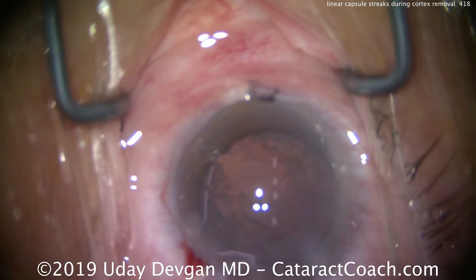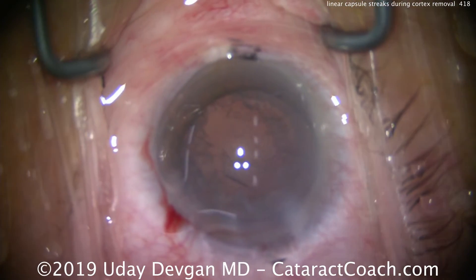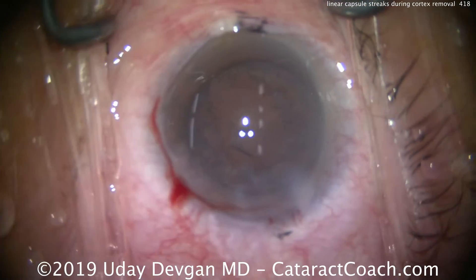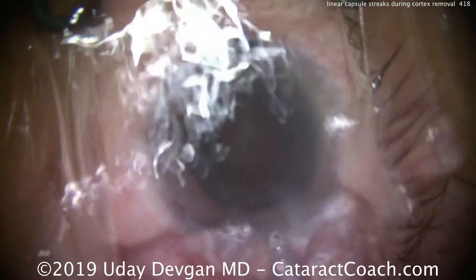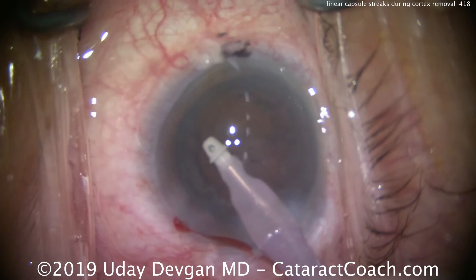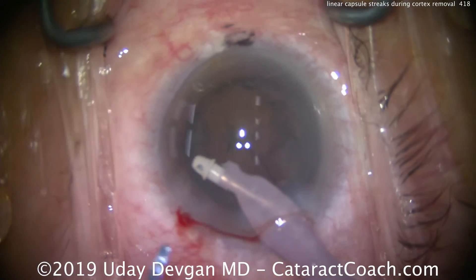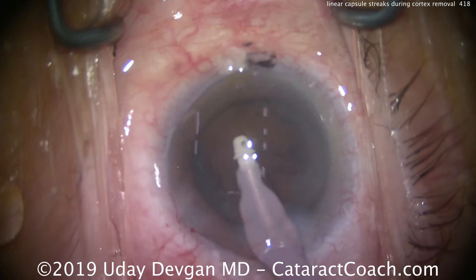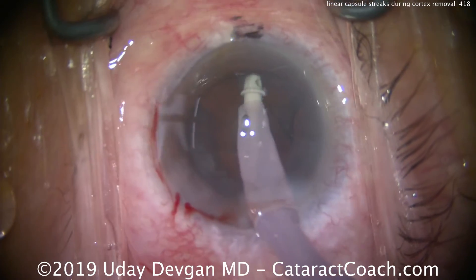Now it's time for irrigation aspiration to remove the lens cortex, and here's where I want you to watch very carefully. I'll put the IA probe in the eye — everything seemed normal up to this point, nothing out of the ordinary. We start to remove some of the cortex, going nice and gentle on this patient, keeping in mind that the tissue is quite old — more than 90 years old.